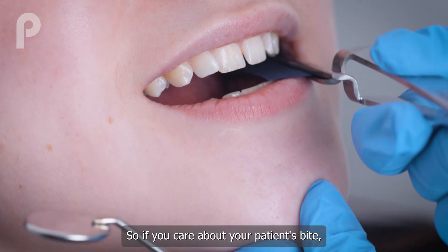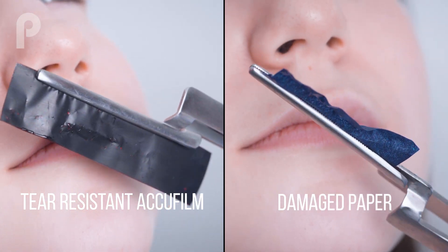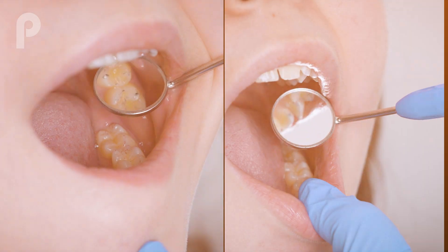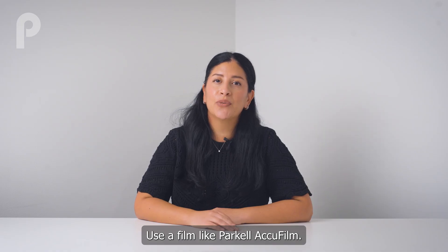So if you care about your patient's bite, don't use the thick paper. Use a film like Parkel AccuFilm.